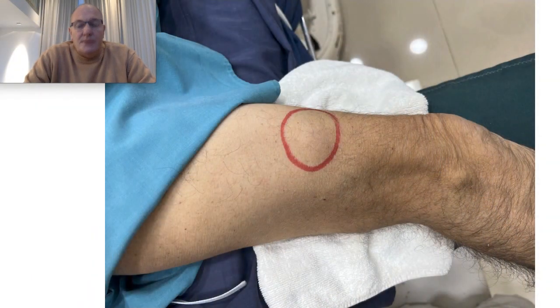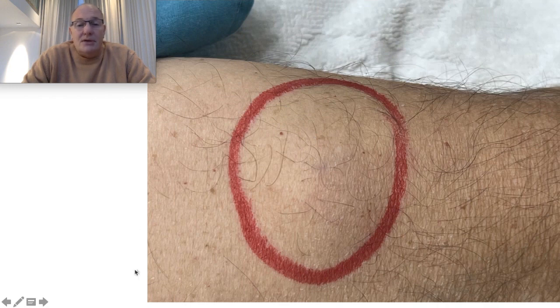This is a medical doctor who has had this lipoma for many years. He didn't want an operation because it's a big one, requiring resection of this area with a lot of stitches. He saw my educational videos and understood that I'm able to remove it through a small incision or minimal incision with laser. Here we can see the markation of the lipoma.